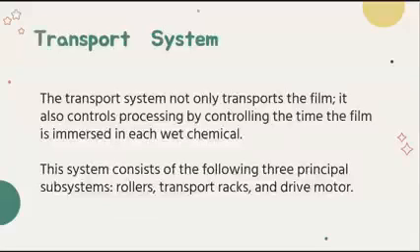And the transport system not only transports the film as the name states, but it also controls processing by controlling the time the film is immersed in each wet chemicals.